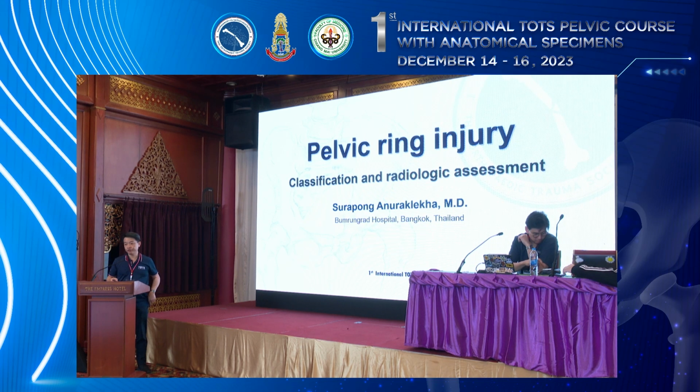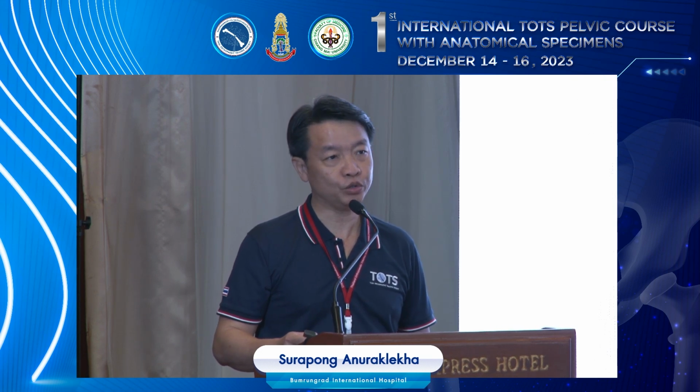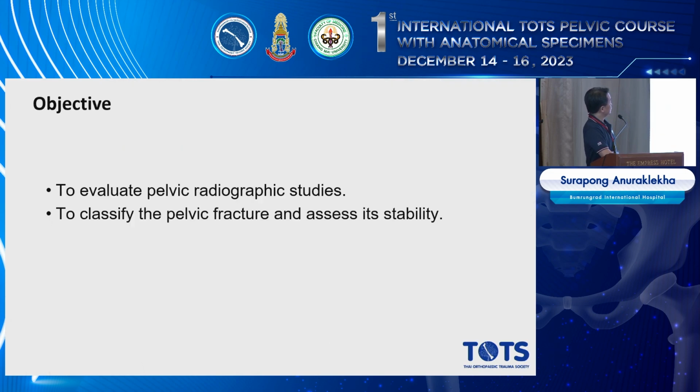My first lecture will provide you some basic information about pelvic ring injury, and for sure, I believe that you already have some experience, so I do not intend to provide the basic lecture about classification and radiology. I think it's not necessary. So we may come to just review and evaluate the pelvic radiographic studies and classify the pelvic fracture and assess its stability, with some interesting points.